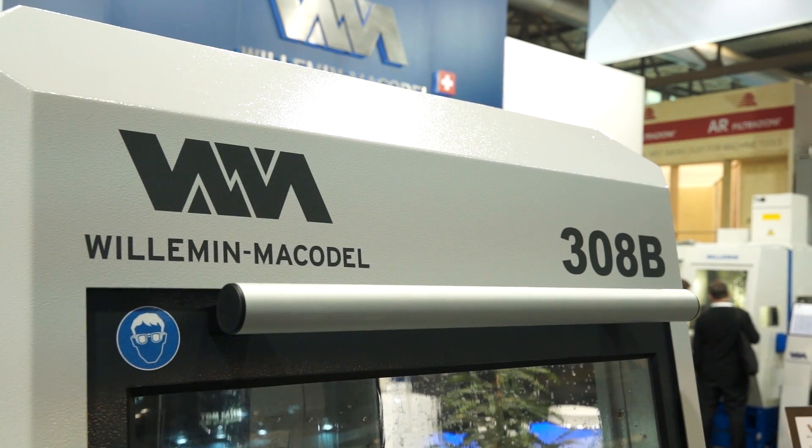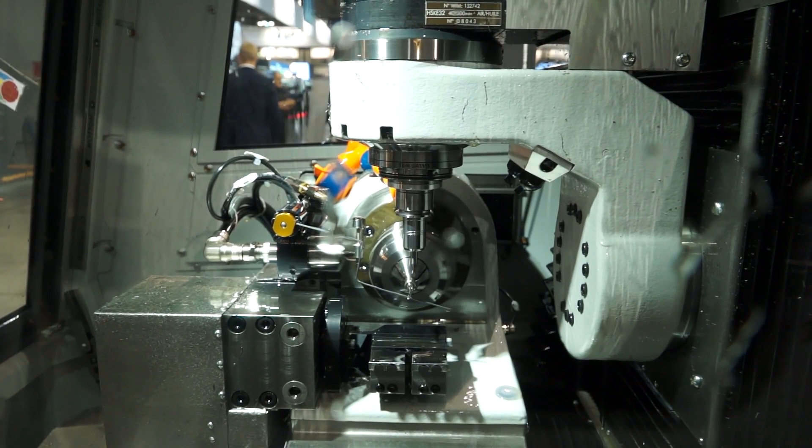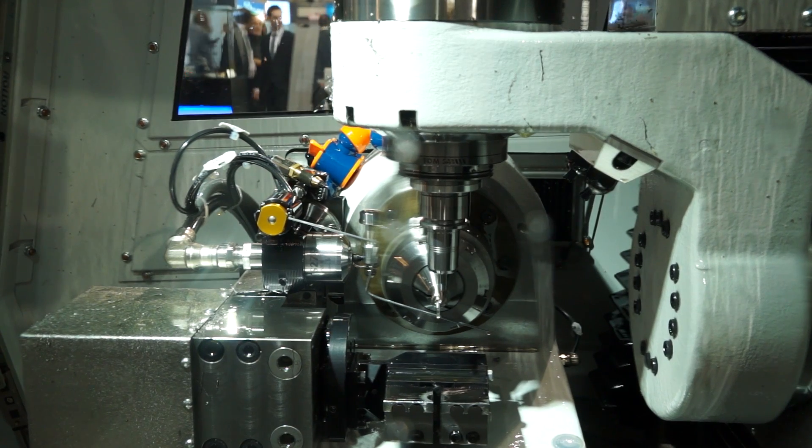We developed the 308B machine especially for dental labs. Dental labs were looking for a very compact, small machine with dimensions allowing it to go through a standard door size — that's why the machine was developed to fit through a door 800 millimeters wide. We then developed the machine with different features, combining bar stock machining for implants and chuck machining from the disc, for example, which makes the machine very unique.